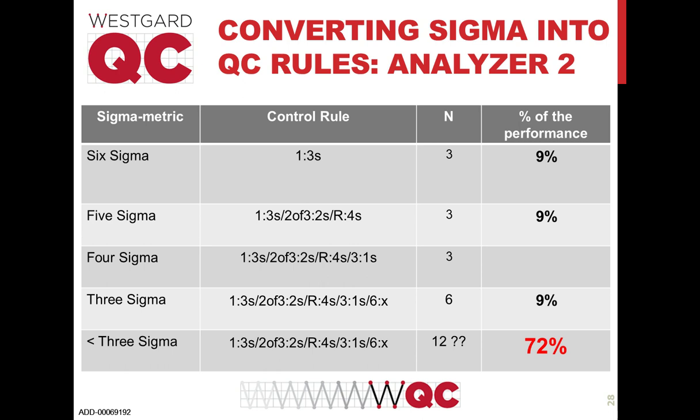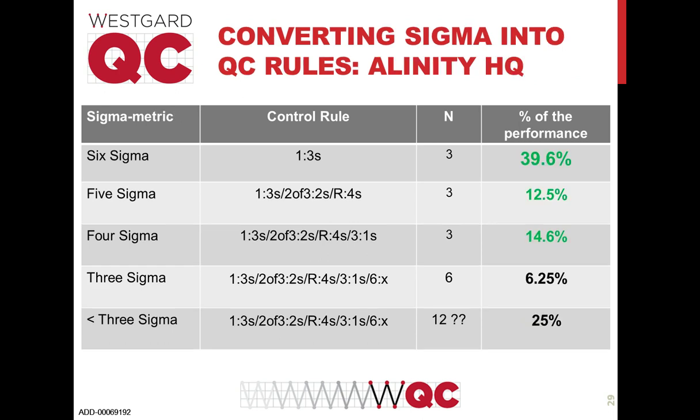It needs to use more controls themselves, not just the usual 2 or 3, but probably more like 6, which, if you're not able to afford running that on a single run, you have to start looking across multiple runs.